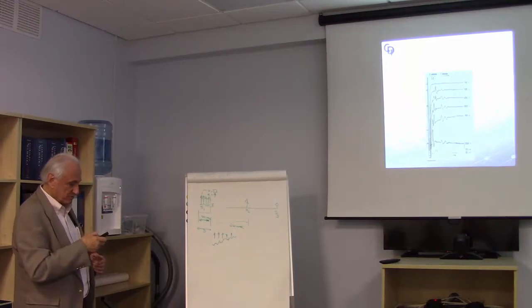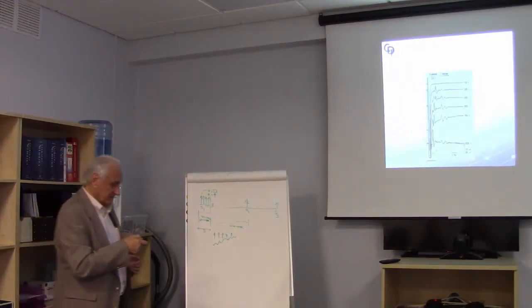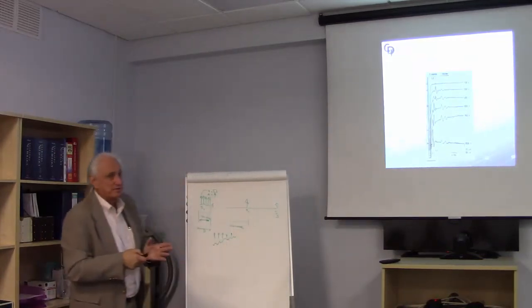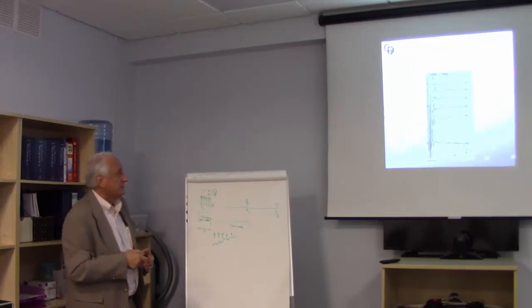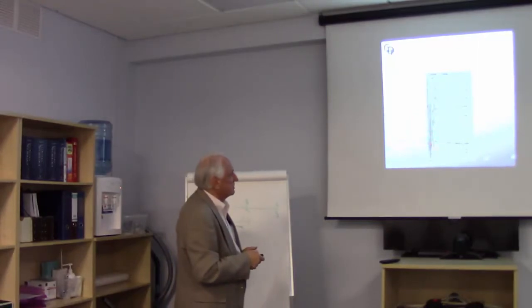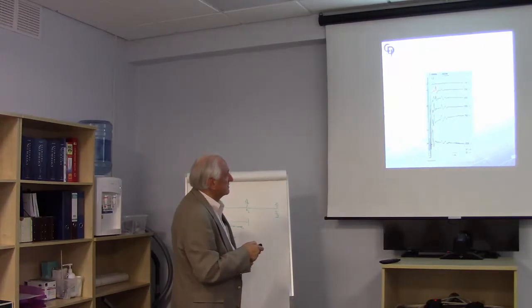Okay, so epidural responses, this is just to represent what they look like. Remember we talked about the I waves and the D waves. Well, these are recorded epidurally, and this is the D wave here. You can see this data was recorded, I forget who actually did this, at 1500 volts. That's the D wave in that region. This activity here are the I waves.